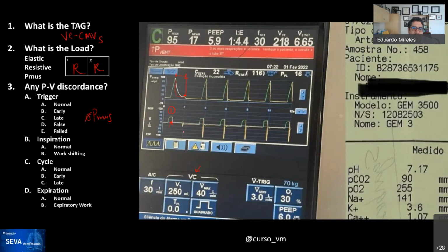So what happens after that is in the next few milliseconds, the proximal airways in the circuit decompress past the point of resistance, and then basically the gas is transferred from the proximal part of the system, proximal to the obstruction, to the distal part of the system. The few cc's of air are squeezed from the proximal airways into the distal part of the system and the lungs, and it takes a few milliseconds because that resistance is so high. Yeah, you mean if the patient was biting on the tube or something like that?